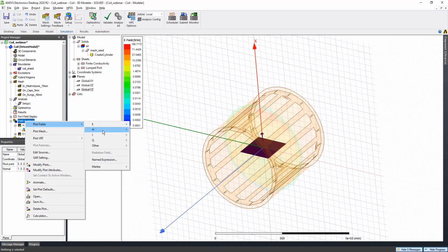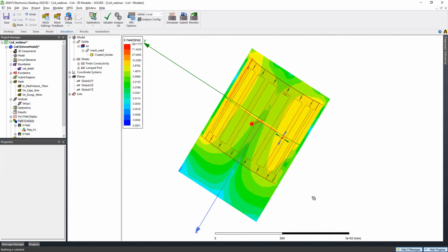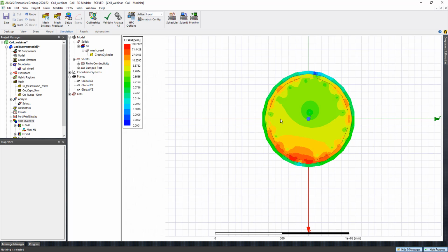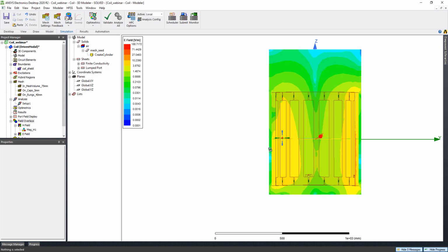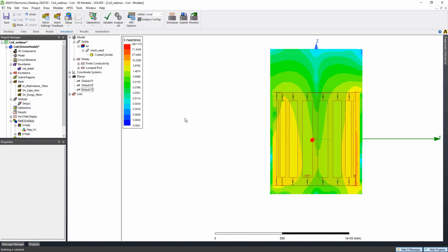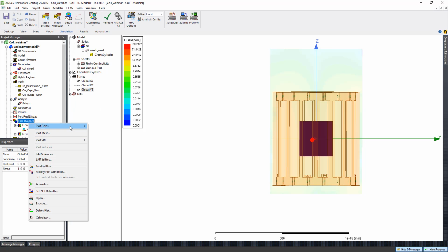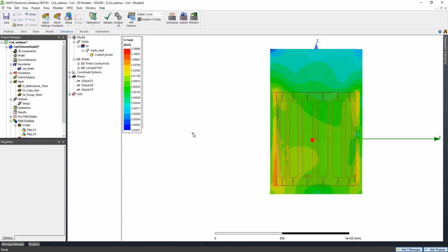So we can add another one to the YZ plane. If we look top down, maybe like this. All right. So we can look at the YZ plane for the E field, and for the H field. This is very simple, right? Okay. So next we are going to link up the tuning capacitors.